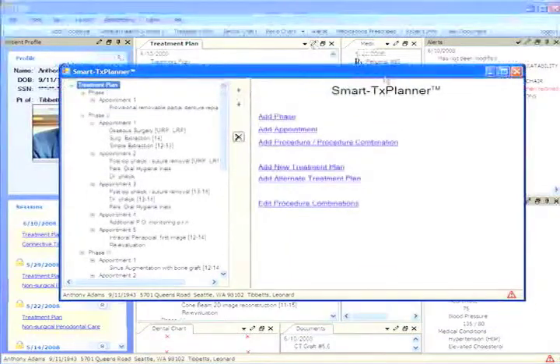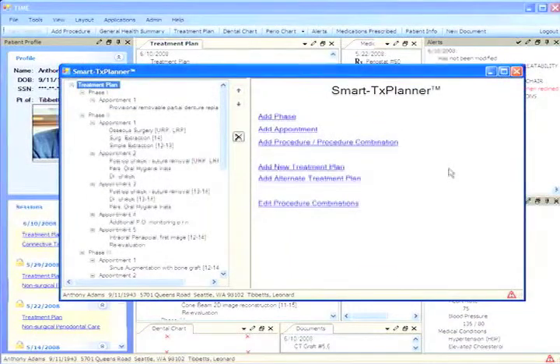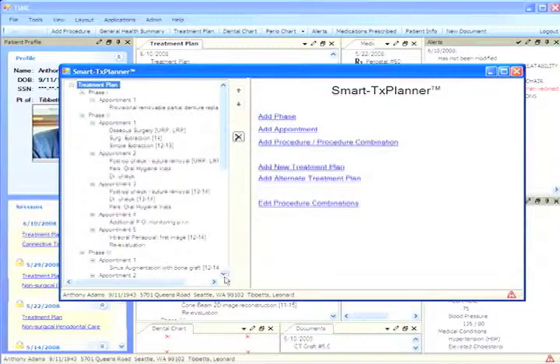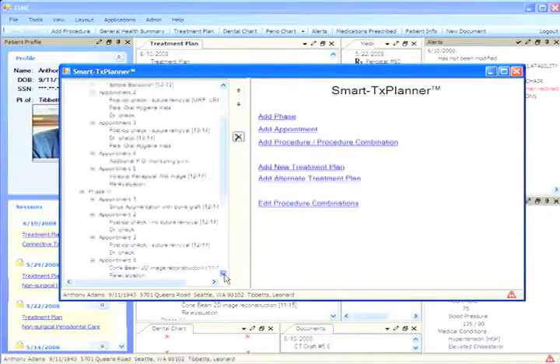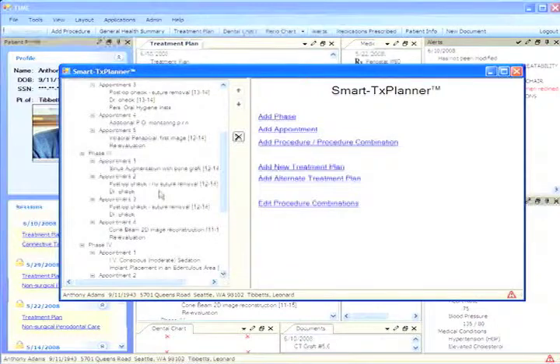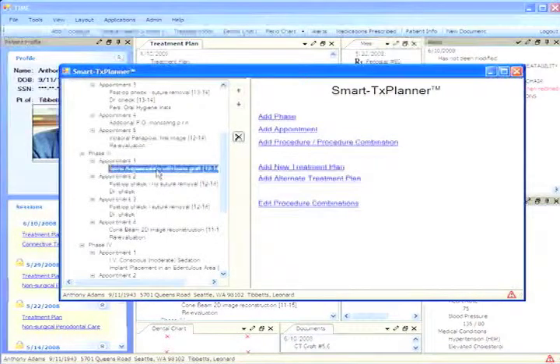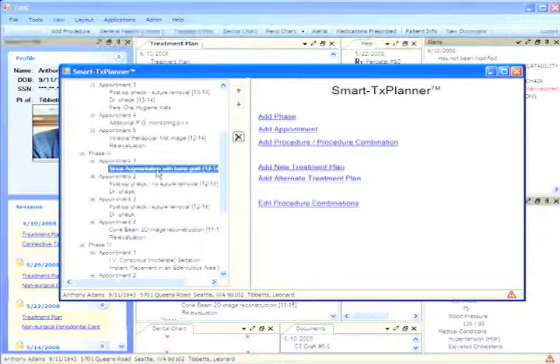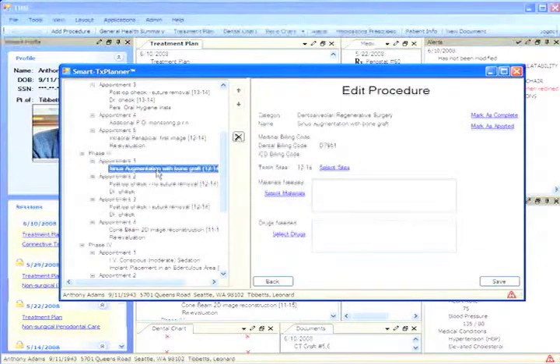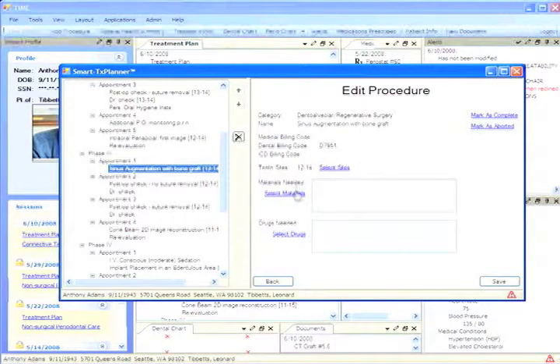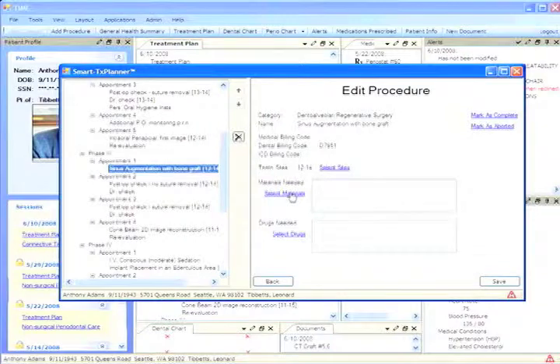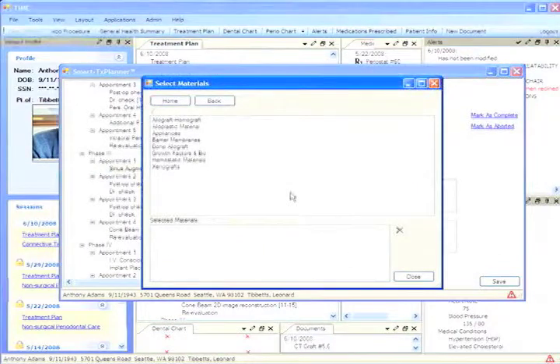Here we see the smart treatment planner. I'm going to scroll down a little ways and show you some of the things that it can do. For example, I'm going to do a sinus augmentation in this particular location. If I double click on that, I want to select some special materials to be present on my tray that day. So I'm going to go into material selection.